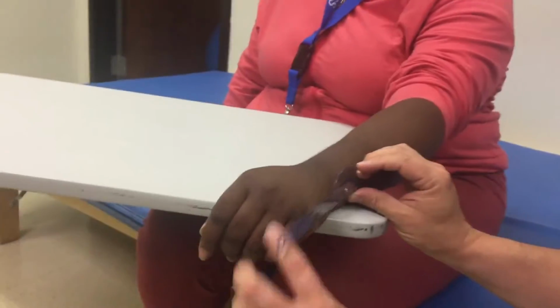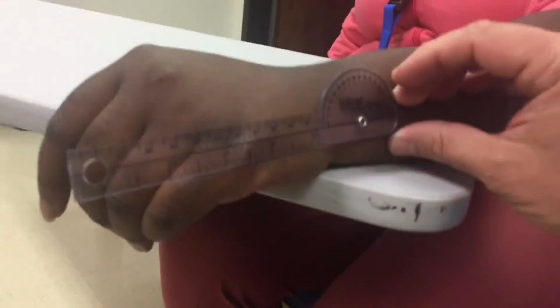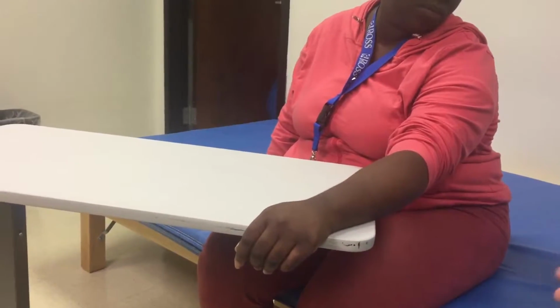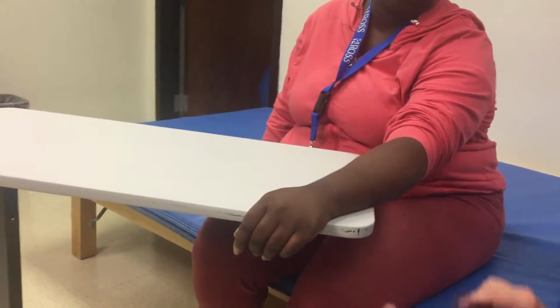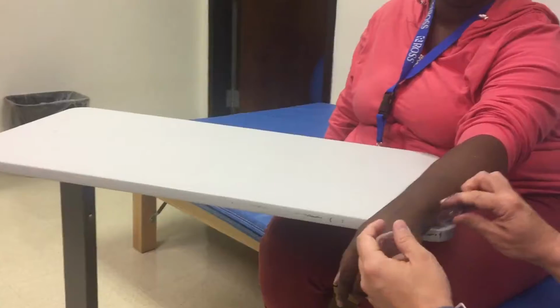Her fifth metacarpal is right here, so the black line is kind of lined up with it. So make sure, for video purposes too, that the black line is lined up with the fifth metacarpal. I mean metacarpal, sorry.